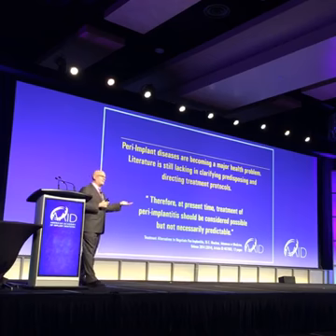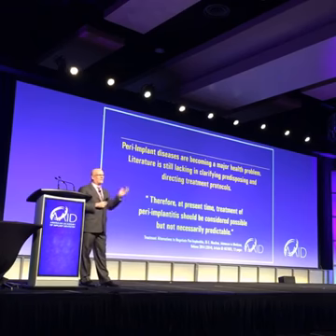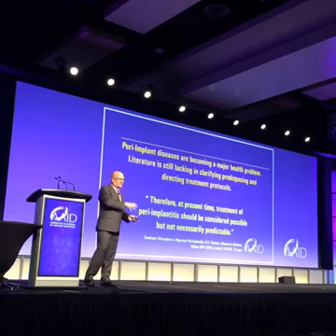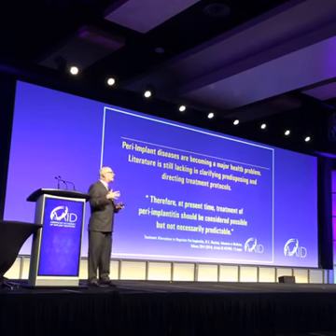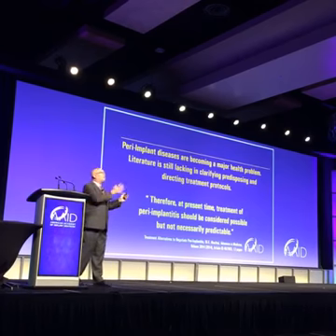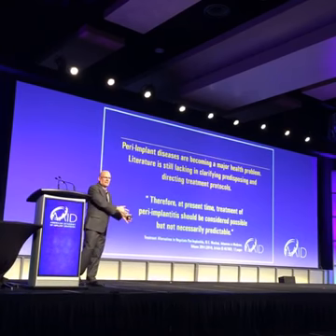I went to another lecture by another doctor who said he doesn't believe in shaving down the threads, and he believes that the erbium is better than anything else to decontaminate an implant surface. So a lot of the treatments that you see, that you read about, depend on who you believe or who you know. There's no set protocol out right now that says, do this, you'll get this result, and that's it.